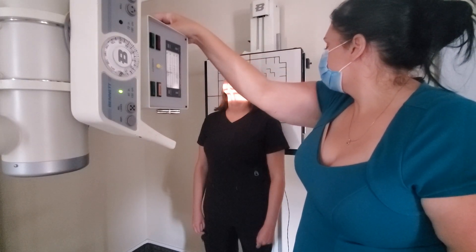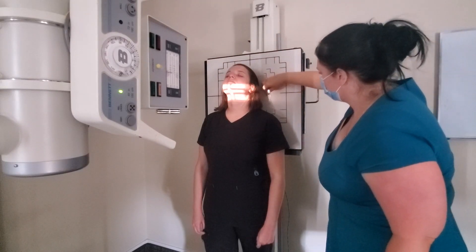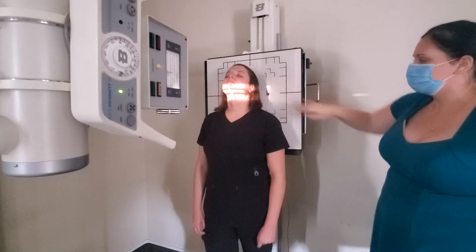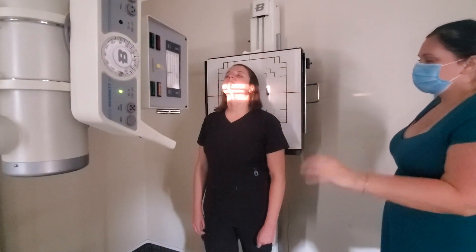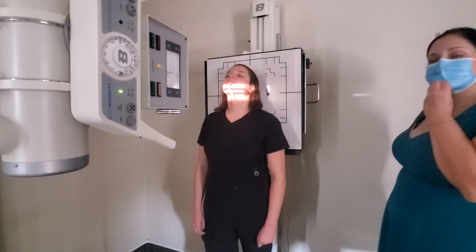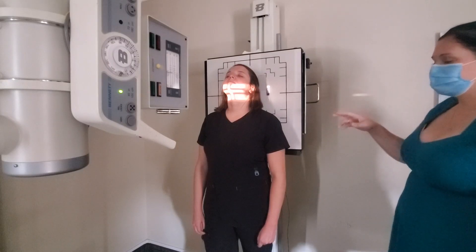Collimate down to a smaller field size — typically it's supposed to be a five by five, but in lab you can leave the longitudinal or transverse collimation open a little bit so that you can fit this within the light field. True AP standing position, chin elevated, make sure that centering is right on the MSP just distal to the chin — that is how you perform a Fuchs method to see the dens odontoid.